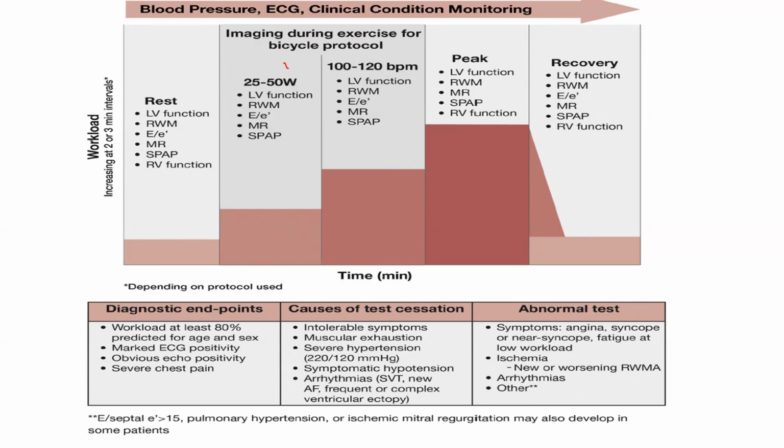Like I said, this presentation will be easier after the presentation on stress test. But essentially, before you do a stress test, you check the indications and contraindications, your patient lies down, you do a 12-lead ECG, you check your BP, you have your baseline parameters before they go onto the treadmill with all the electrodes connected, and they start the stress test.